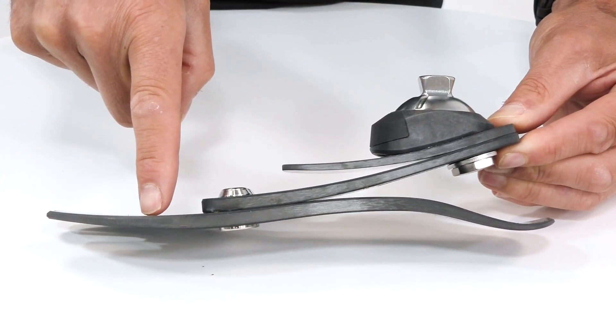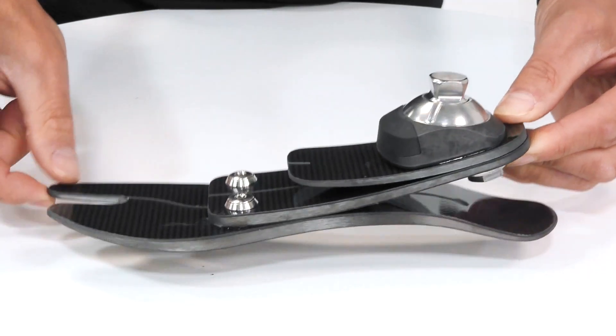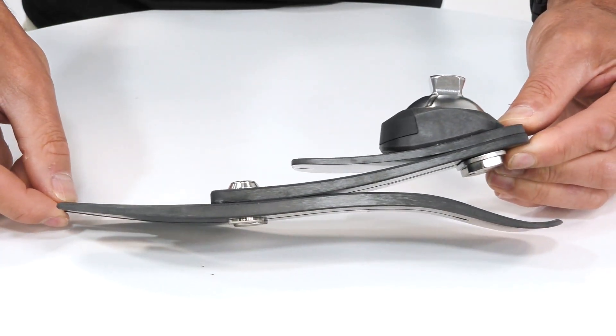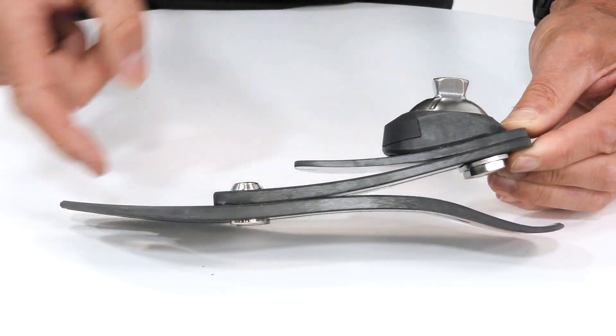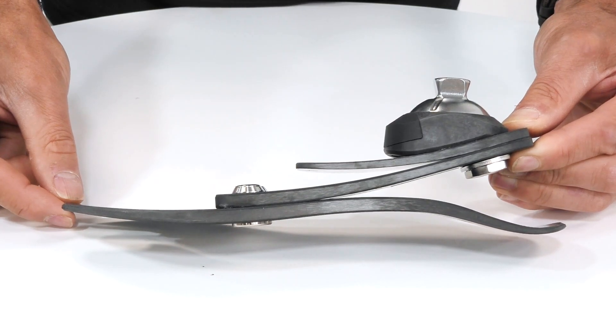So towards late stance and push-off, we have huge amounts of ankle power generation, aided by this full-length toe lever that gives us great ankle power — so much so that the Proflex LP actually exceeds the ankle power generation of our standard Vari-Flex prosthetic foot.